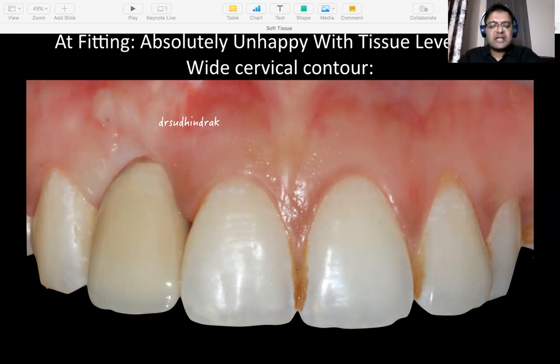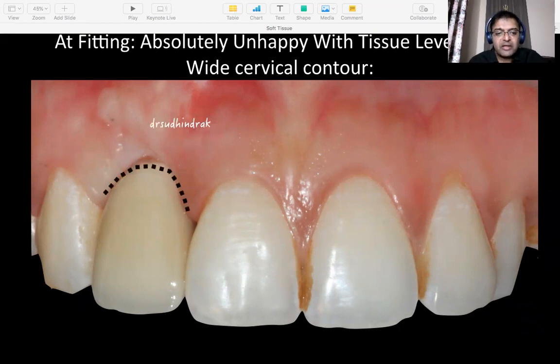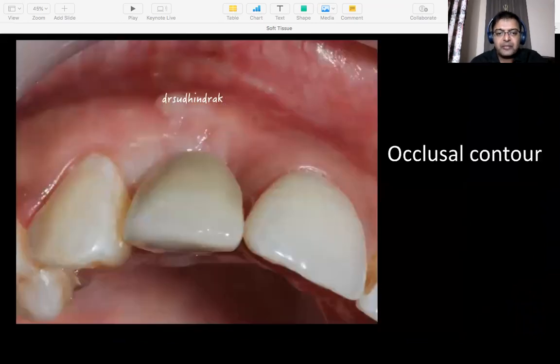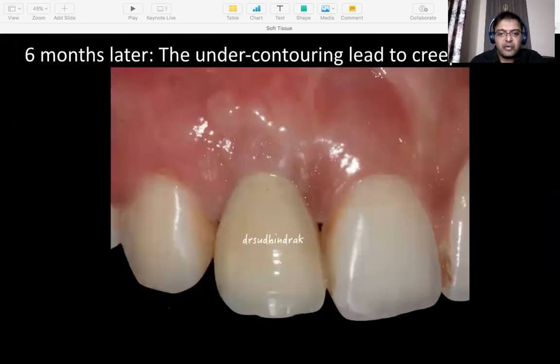You have to understand this is a case that belongs to what we call a high bioform, where the interdental papilla is literally at the junction of the middle and the incisal third of the teeth. Teeth are triangular. Every time I have to replace triangular looking teeth, it's a disaster. It's very, very tough. So what we did was we under-contoured this crown, we thinned it down to the way it looks here, and then left it. We followed it, we forgot it. Occlusally, it looks good. And as we forgot it, 6 months down the line, when the patient comes back for follow-up, because it was under-contoured now and the tooth looked more triangular-ish, the soft tissue started creeping.